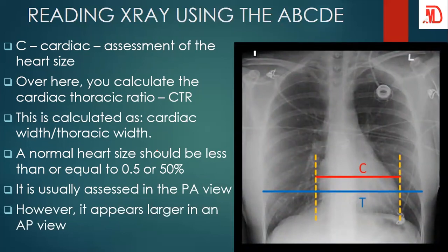Now, over here there are two ways. Some people will prefer to draw a midline, a line here. When we say midline, you draw a line through the vertebra, or the spine. An imaginary straight line, basically. Good. And then you see this is how the heart is. Good. And then over here we have this.